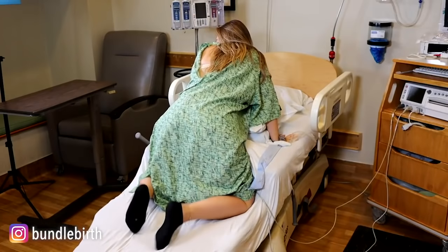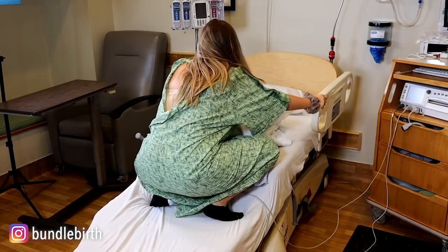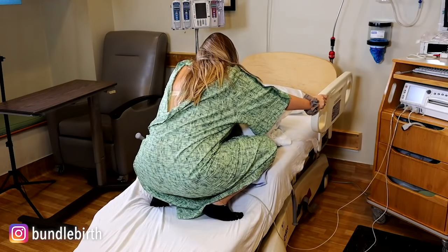Another squatting option is to actually turn around on the bed — be very careful to stabilize yourself with the side rails or the handlebar things. You can lean on the side of the bed, lean forward, or go up and over as well.